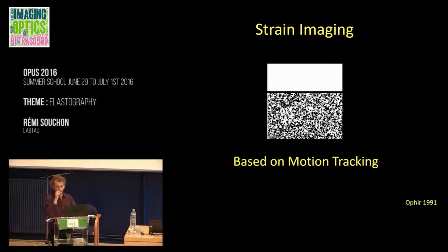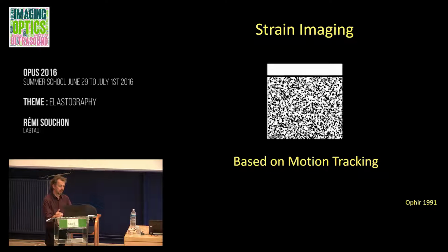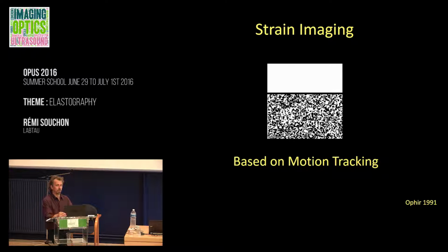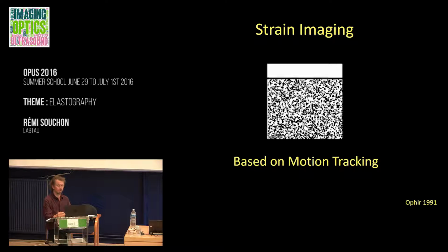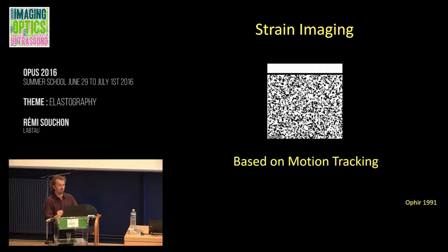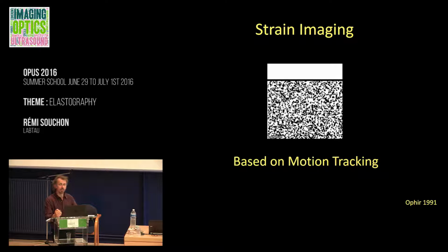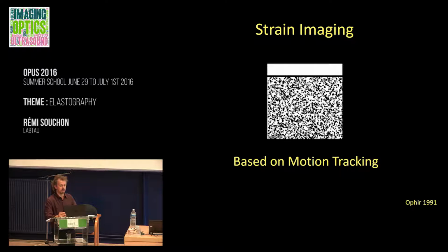It's not unique to ultrasound. Everybody knows that. It can be a very basic image analysis process, and you could use even some very conventional tools like optical flow or others to do that. But we'll see that in ultrasound we have additional information. We don't only have the image, we have the underlying information, that is the signal. And that will allow us to go to much better resolution and detection.